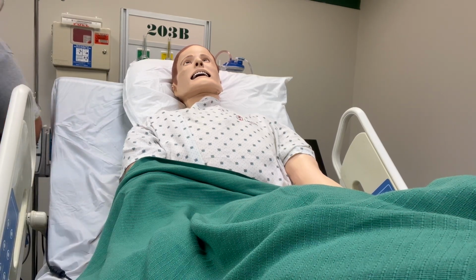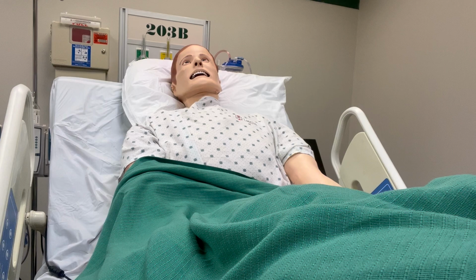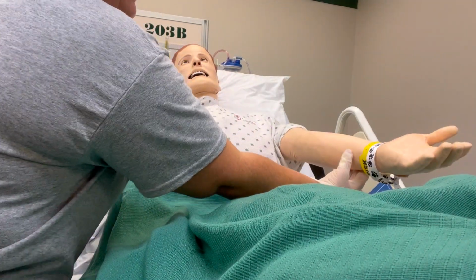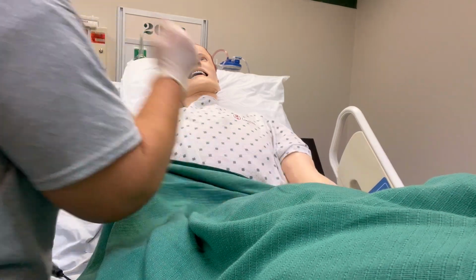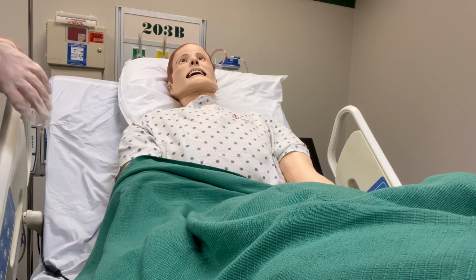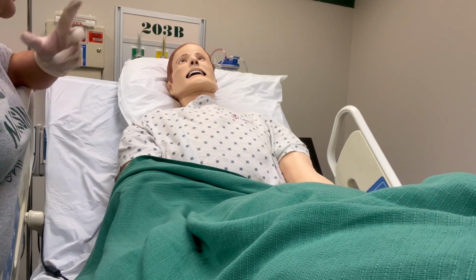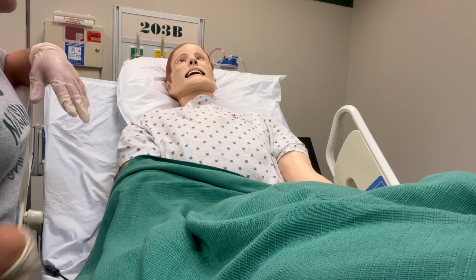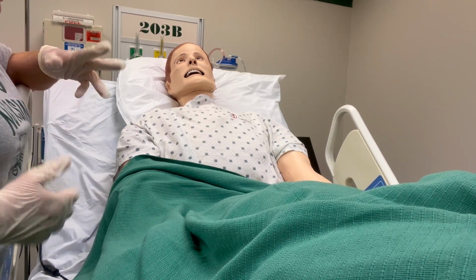I'm going to get some hand sanitizer on and put on my gloves. Would you care to tell me your name and date of birth again? All right, Mr. Smith. Do you have any allergies? No allergies? Okay. So I have an order to give you a heparin injection, and it's what we call a subcutaneous injection, just meaning that it's going to go in the fatty tissue on your body somewhere.